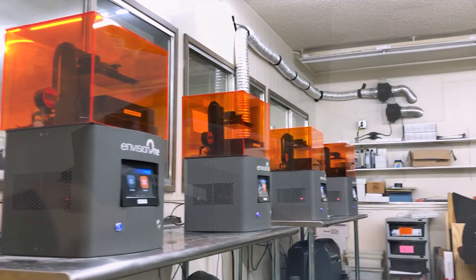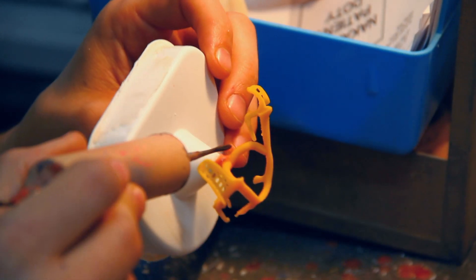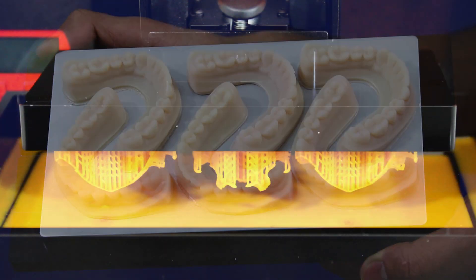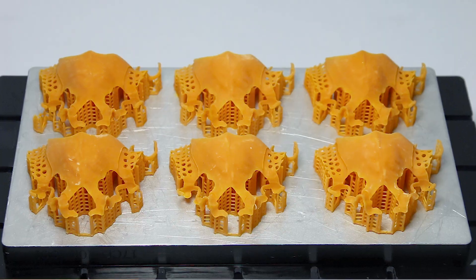At present we have four Envision 1s, and we use them for a combination of models and partial dentures. We print roughly 35 full arch models per day as well as 25 quadrant models. In addition to that, we print 40-plus RPD patterns utilizing these four printers, so they get very thorough use.